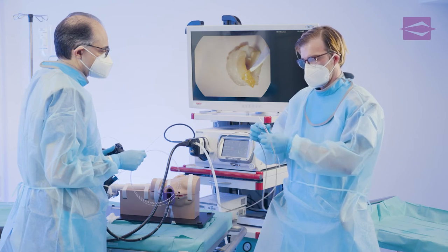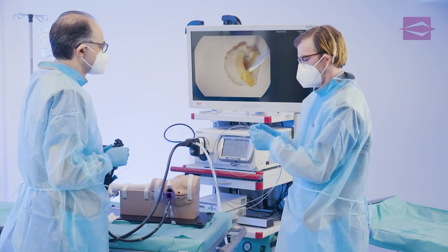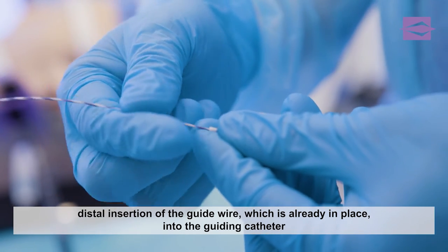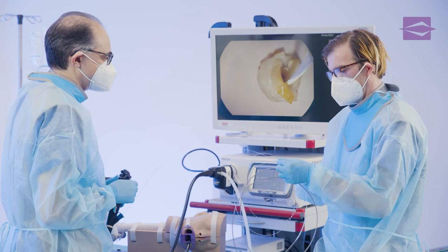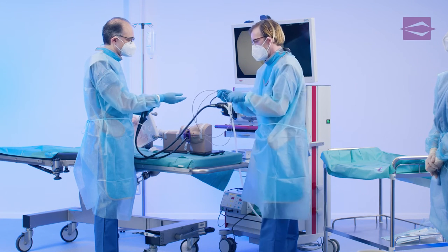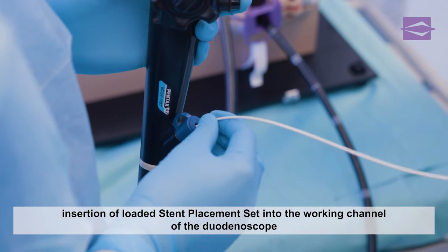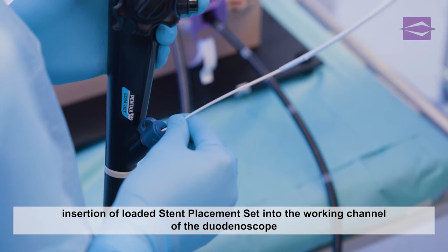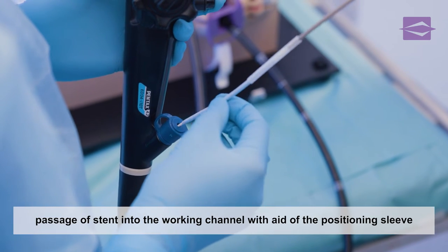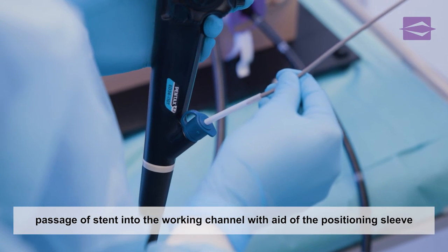The examiner and assistant prepare the insertion of the loaded stent placement set. The guide wire is inserted distally into the previously irrigated guiding catheter. The guiding catheter slides slowly through the biopsy valve into the working channel. The examiner carefully slides the stent into the working channel, making sure that the positioning sleeve protects the distal flap of the stent from bending over.